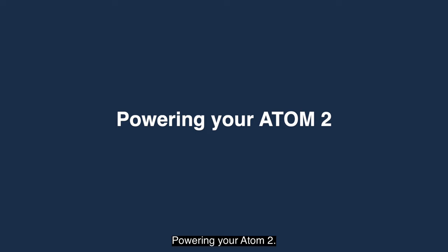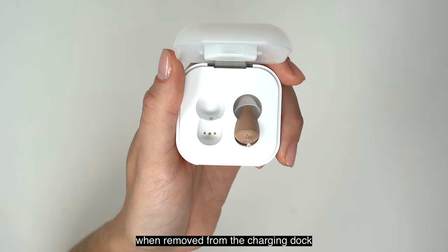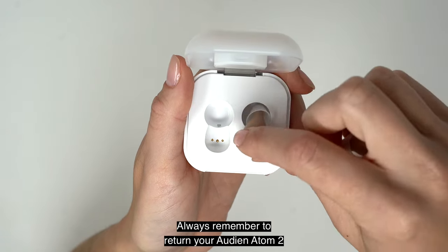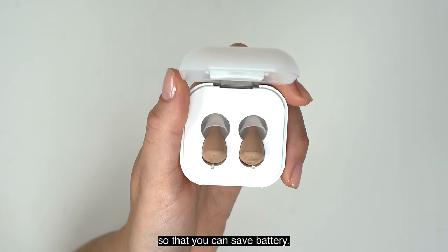Powering your Atom 2 is easy. The device automatically turns on when removed from the charging dock and turns off once placed back into the dock. Always remember to return your Audien Atom 2 to the charging dock when not in use, so that you can save battery.